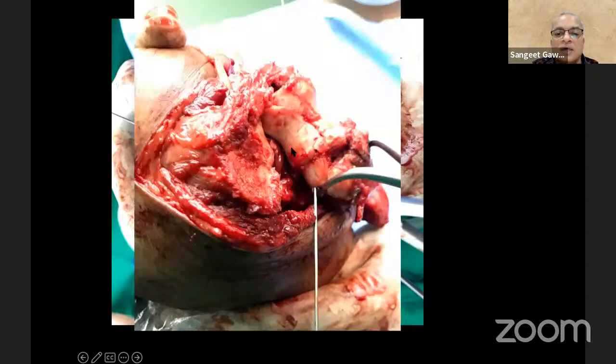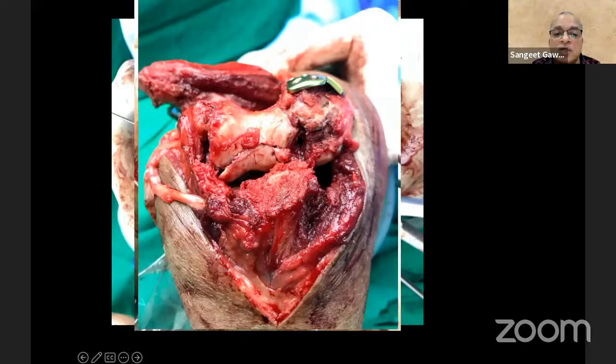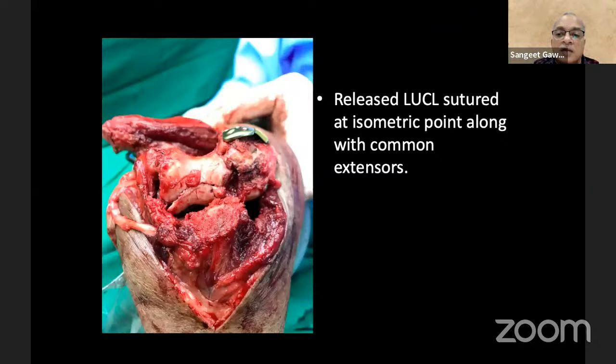Okay. So this is how it looks like. There is some defect which we filled up with cancellous bone. There was a cartilage loss, but this was not on the anterior side. This was the lower side or the posterior side, where there is very little role of the capitulum, very little role of the cartilage. So this is how we placed the plate posteriorly after having reconstructed. And then the released LUCL, which was on this side, was sutured at the isometric point along with the common extensor. This is his post-op X-ray.